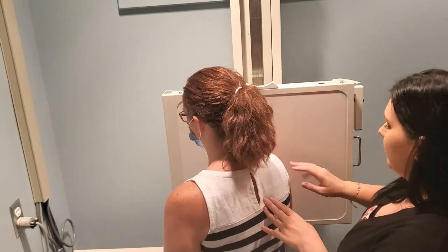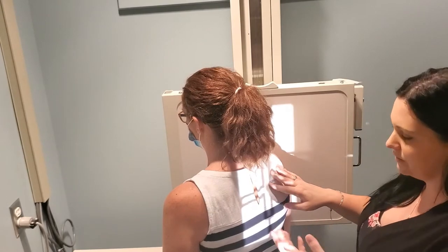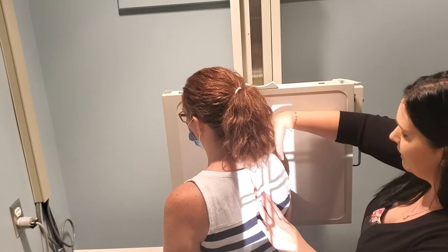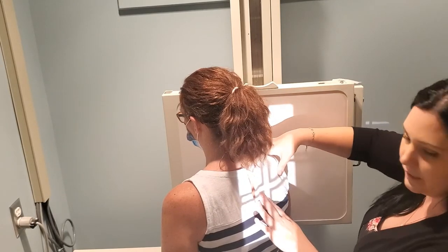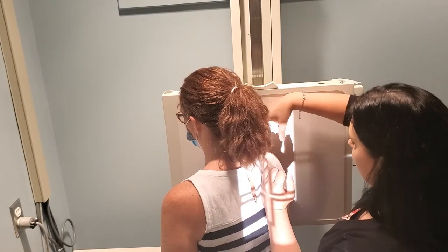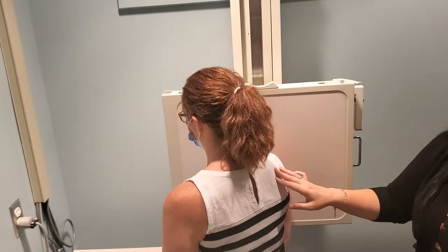To summarize: use a 10 by 12 inch cassette. The patient is rotated anywhere from 45 to 60 degrees, completely dependent on body habitus. Feel for the medial border and inferior angle to make sure everything is included. Cup the humeral head to center it in your bucky and for the CR and cassette. Bring your medial border right into the center of that cup, make sure your patient holds really still, then go and expose your image.